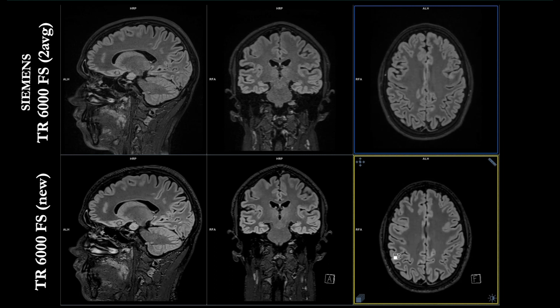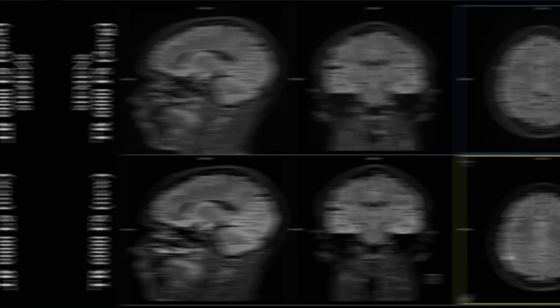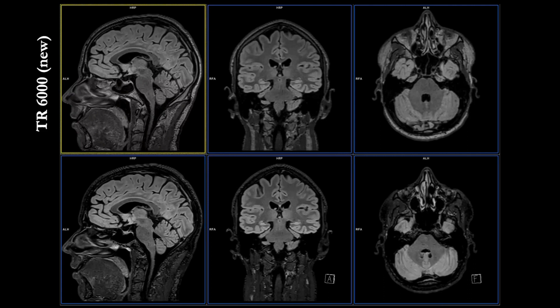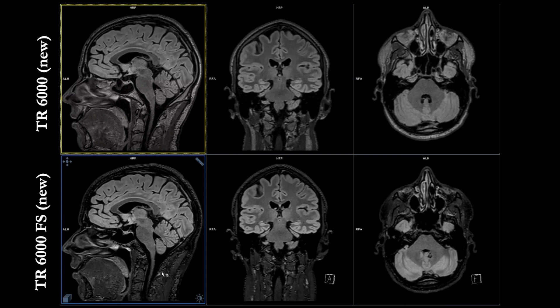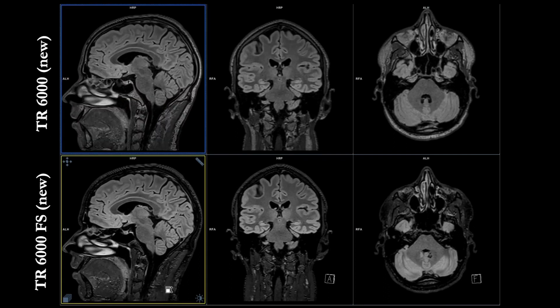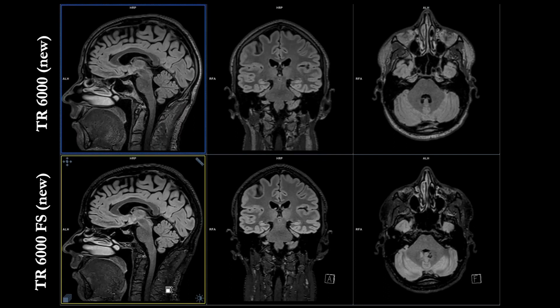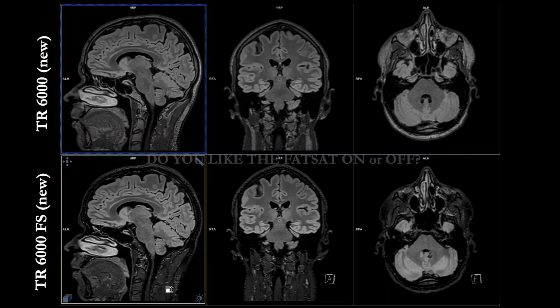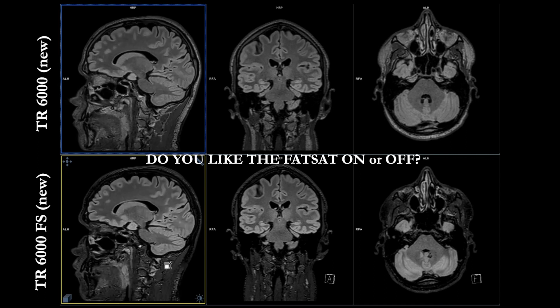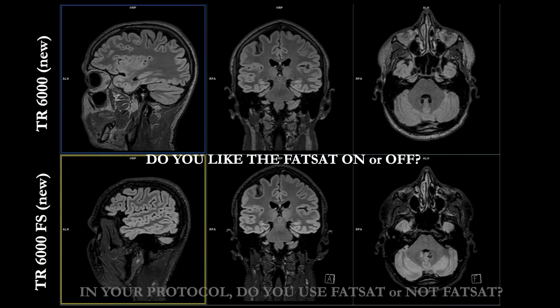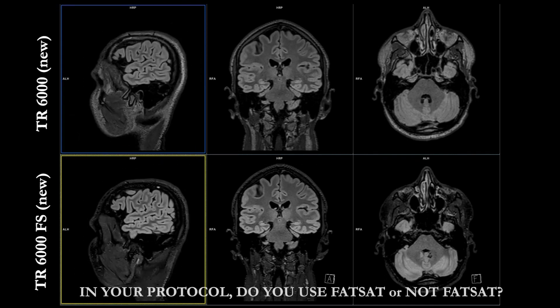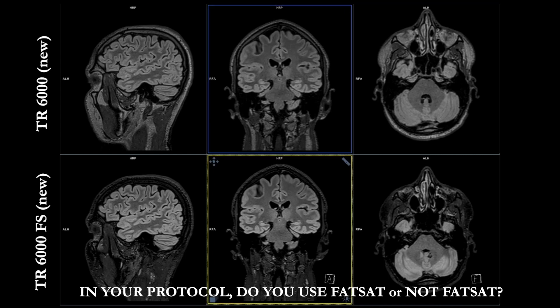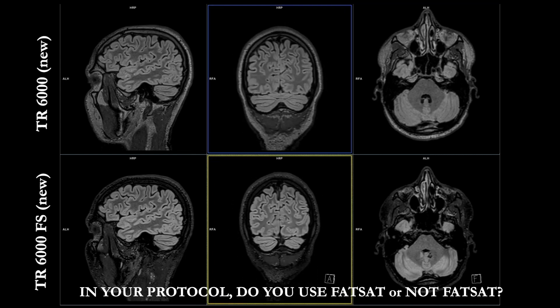All right, let's compare the next images. The next two images right here: the upper row is the one I optimized with the TR 6000, and the lower row is the same here, I optimized that one as well, but there's only fat sat on. Let's scroll through here and check the image quality. So my question to you is: are you liking the fat sat on or off? In your protocol, do you use fat sat or not?